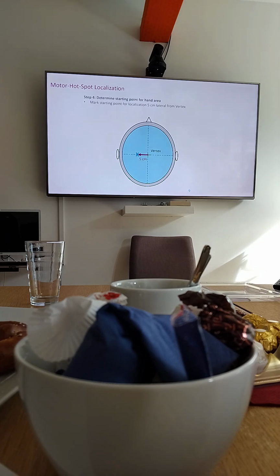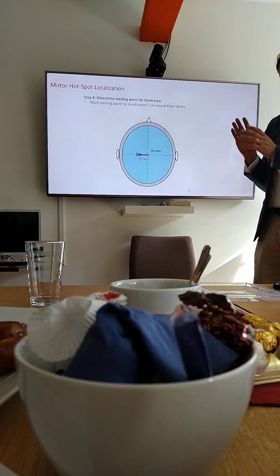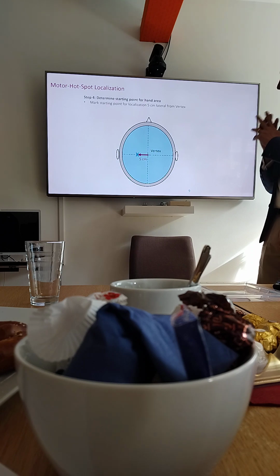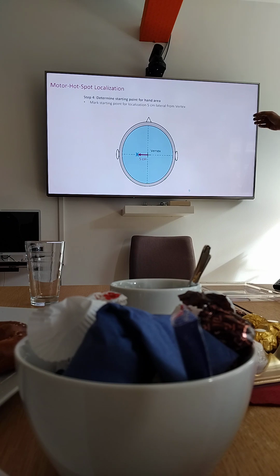Here you see from the vertex, it is 99% of the whole population. The motor hotspot is here within this region. So this is a good starting point to search for the motor hotspot. 5 centimeters to the left from the vertex.